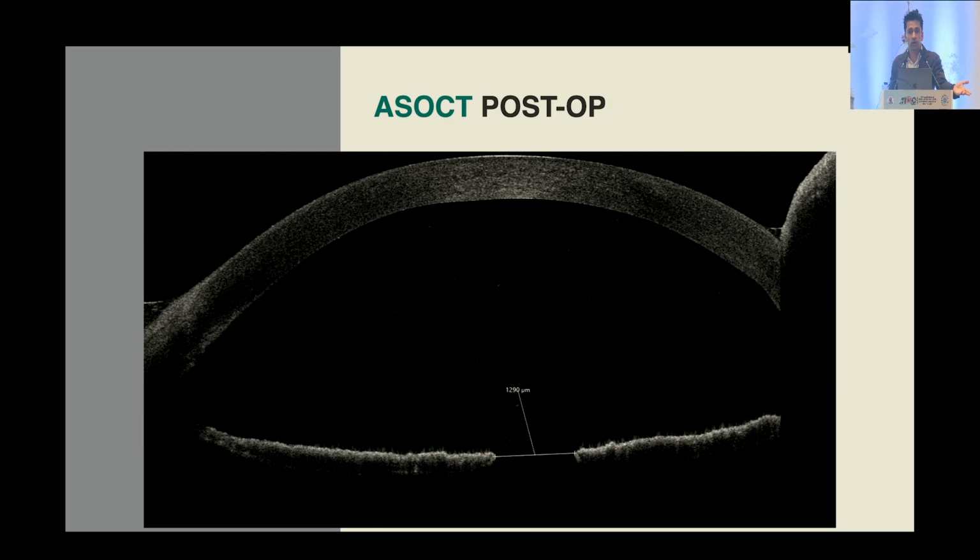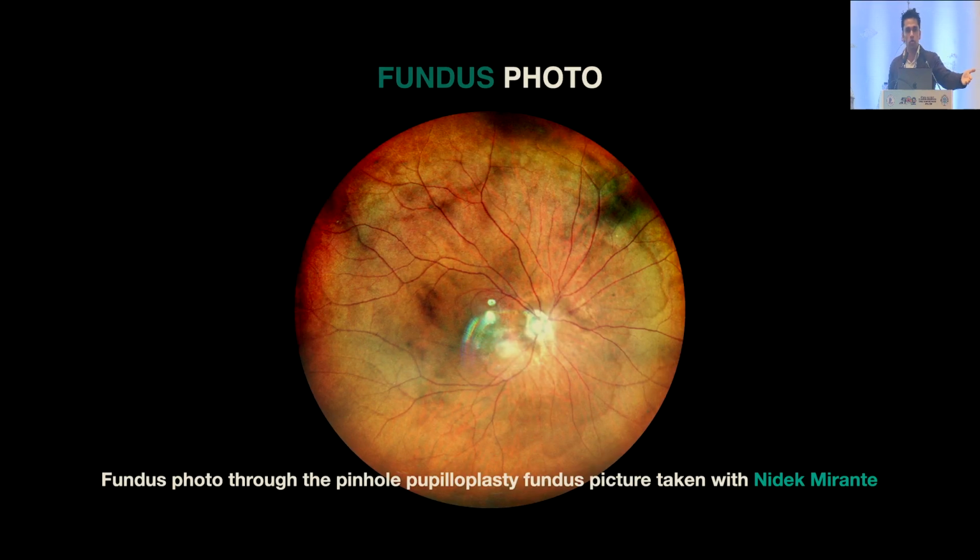Retina, how am I going to examine the retina? You're making this size permanently, and so on. I mean, these are not the questions that my patient is asking at all. They are not asking this question. We are asking each other this question, which is fair, and I think it's a fair question. But if you use the new age fundus cameras, you get at least 160, if not 180, degree good view of the fundus, and you are able to view this.